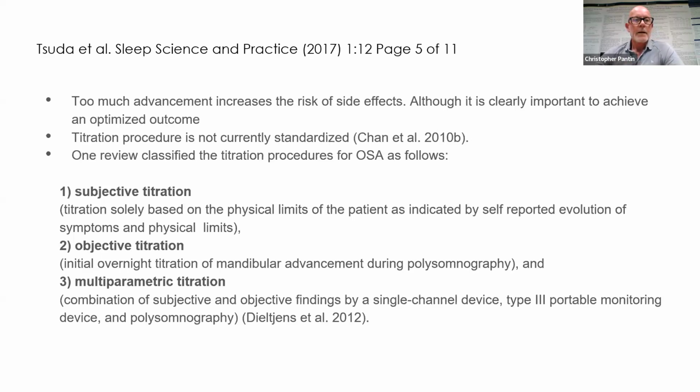Okay, and this is following on still. So too much advancement increases the risk of side effects, although it is clearly important to achieve an optimized outcome. I guess in Japan they might be more stoic than others, and they can put up the pain, but the pain will limit how far you can protrude the mandible. Although if you do it slowly and carefully, most patients do acclimatise surprisingly well to large protrusions. Titration procedure is not currently standardised, as I just said.